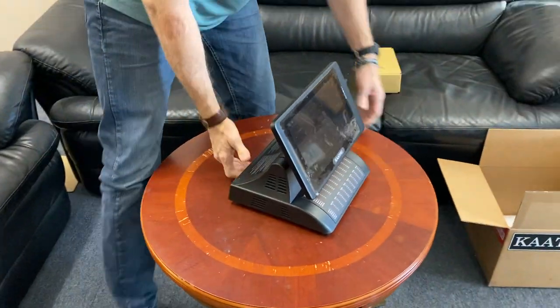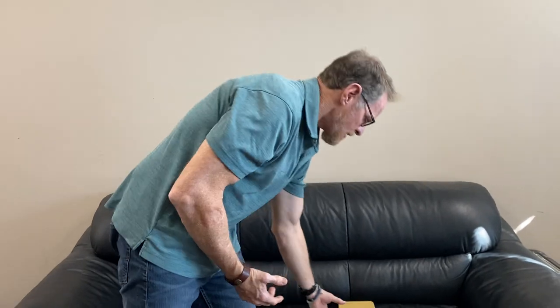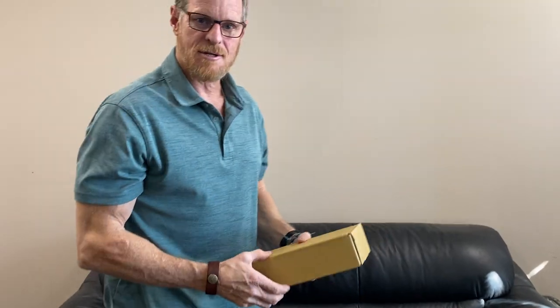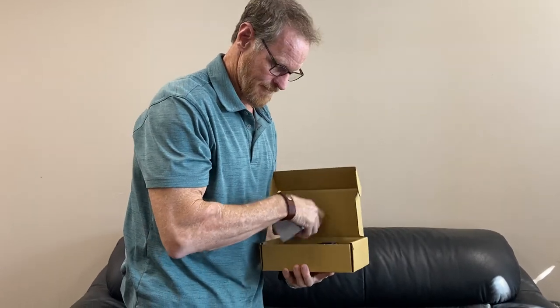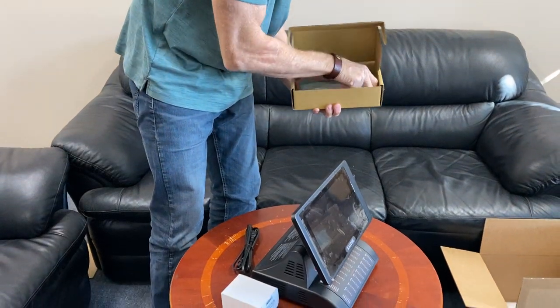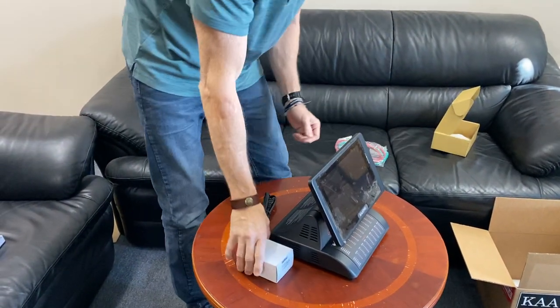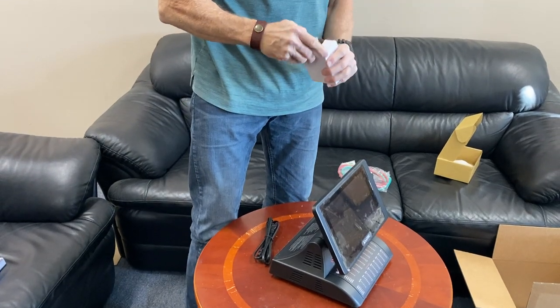The next piece is the power cords and the air tubes — they're all in this separate box. Let's open it up and take everything out. I'll set the air tubes aside for now and let's get the power cord plugged in.